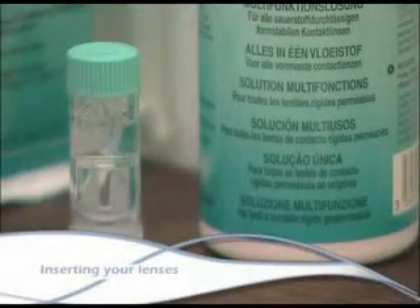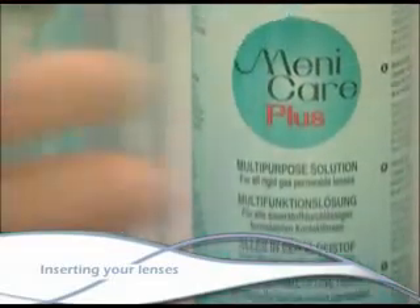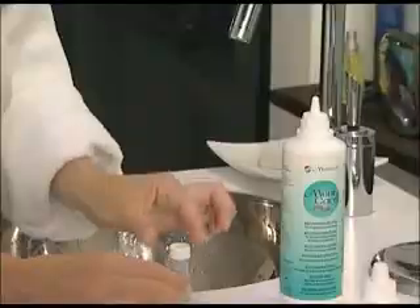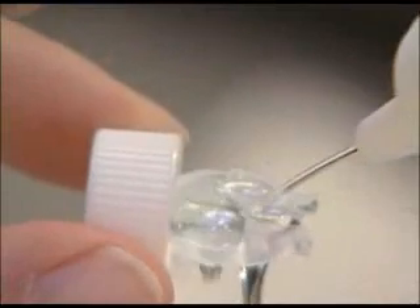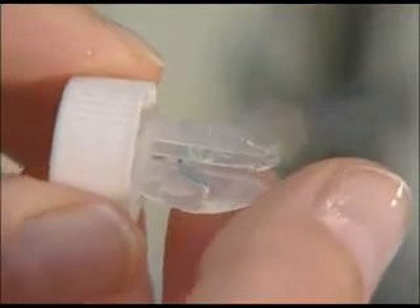Be in the habit of always starting with the same eye, for example with the lens on the right, in such a way as to avoid dropping your lenses. Unscrew the right cover of the lens case with your left hand and carefully rinse the lens in the case using the Menicare Plus solution. Place the right eye lens on your right index finger using your thumb for support.